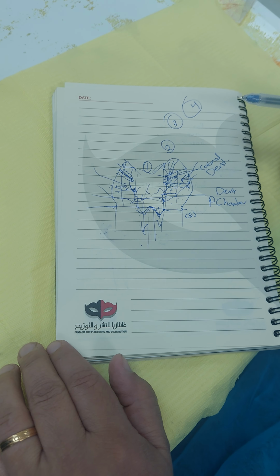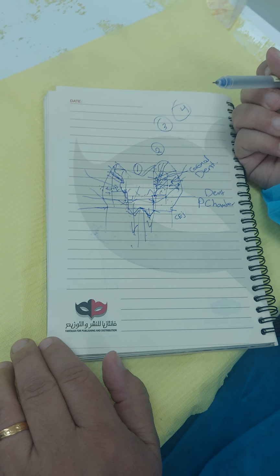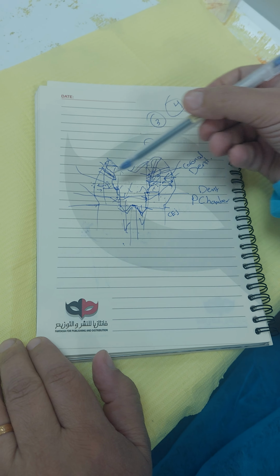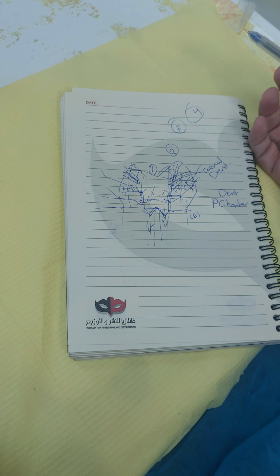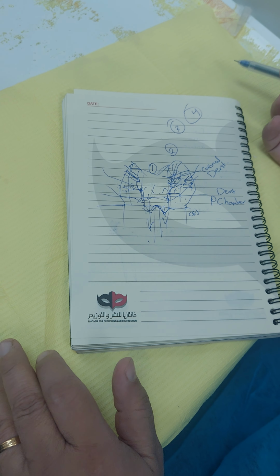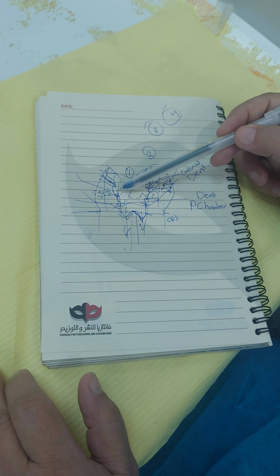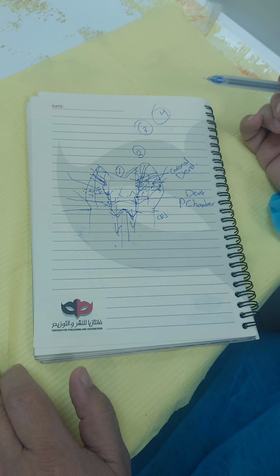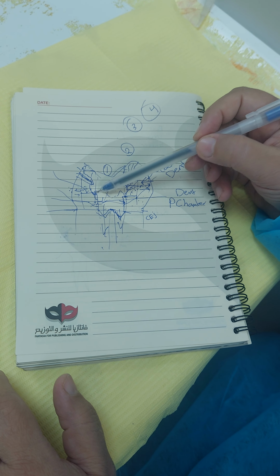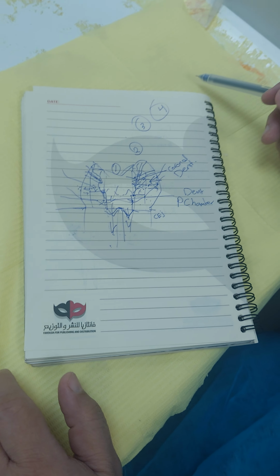Disinfect the dentine as you disinfect the canal. Leave also disinfection material like sodium hypochlorite to disinfect the dentine here. And this is, by the way, the CaResolve technology, where we disinfect affected dentine if maybe there is remnant of infected tissue. But other than friable tissue, don't remove from the dentine, please.